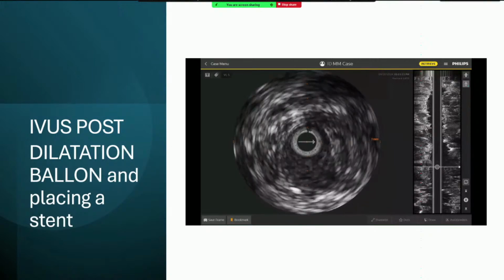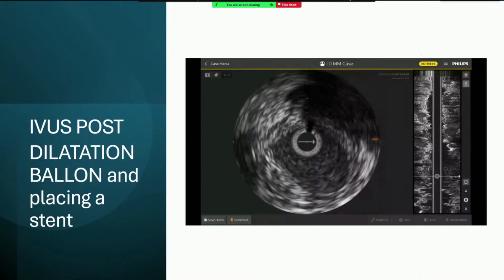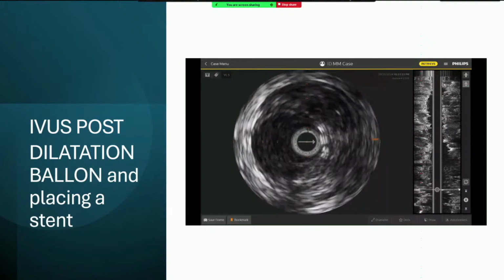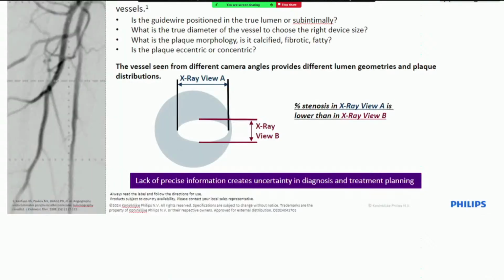And finally, we reach again the stent. And now the stent material. And finally, yeah, so there's a bit of stent still to be seen. Yeah, next slide, please.